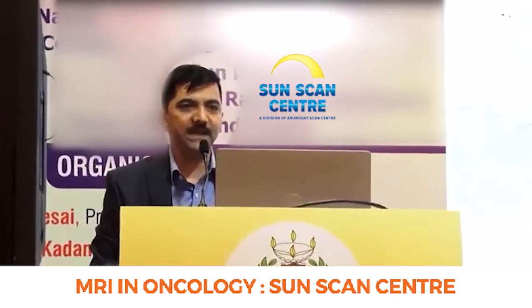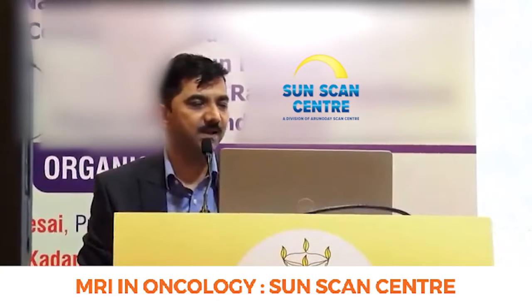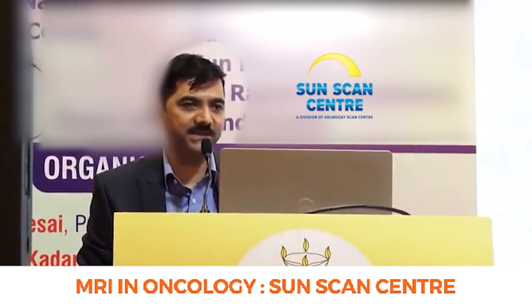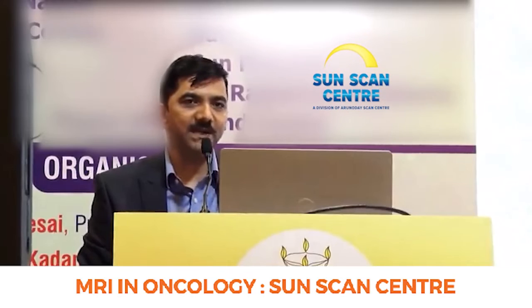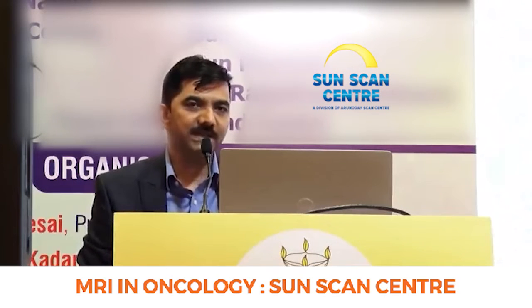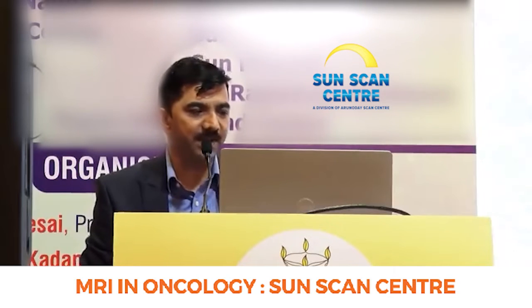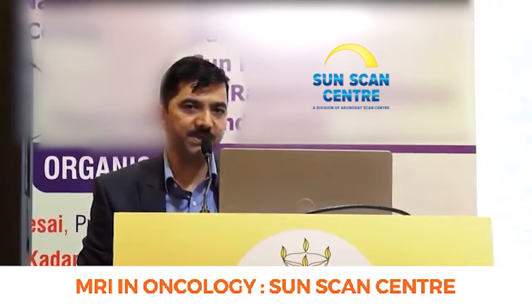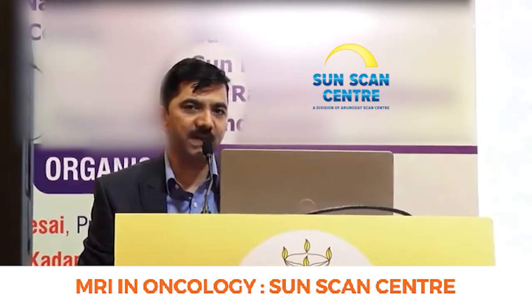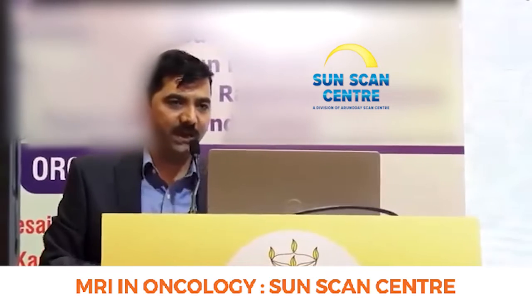Well, definitely it's multiplanar imaging. That is, you can image in different planes with MRI with the patient in the same position. You have multi-echo imaging. That is, you have different sequences. And these sequences enable you to do the diagnosis very accurately. High resolution, most definitely. Contrast MRI, all of us are aware that whenever the need arises, we do contrast MRI.